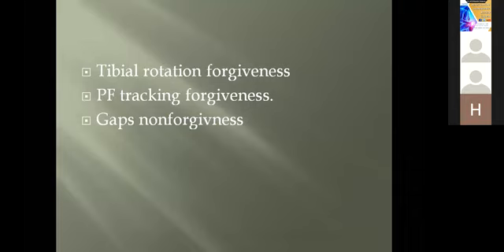But patellofemoral tracking forgiveness, again, it's related to the previous point. If you have an abnormal TT-TG distance, and you have some confusion to adjust the rotation, this rotation of the polyethylene on the tibial base plate is forgiving in the patellofemoral tracking for you in the operation and for the proprioception of the patient postoperatively.